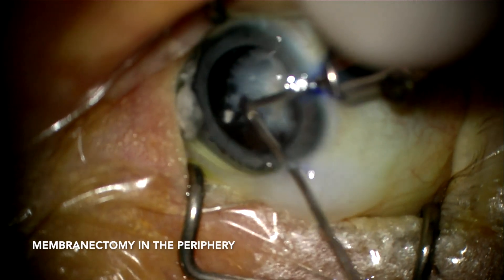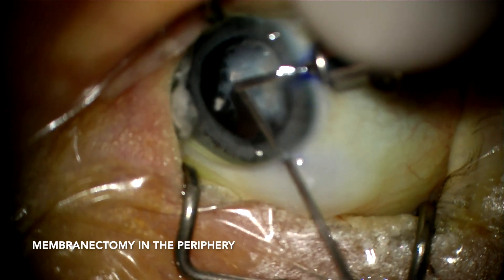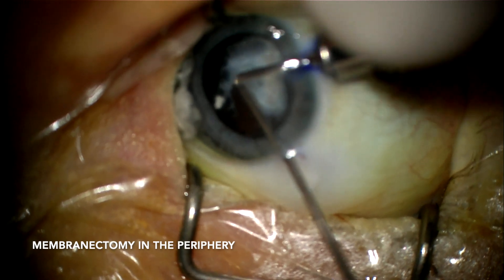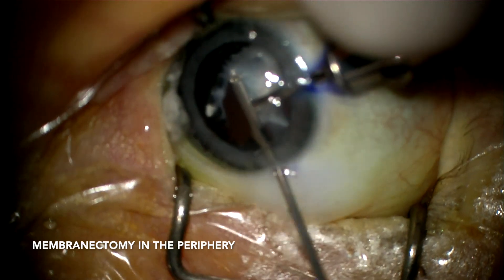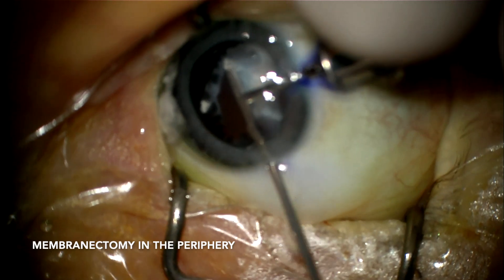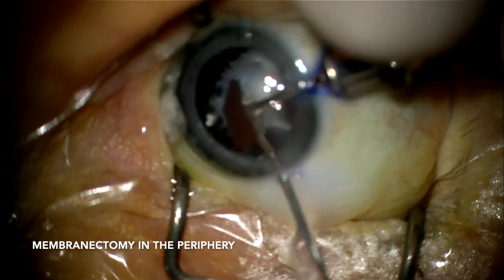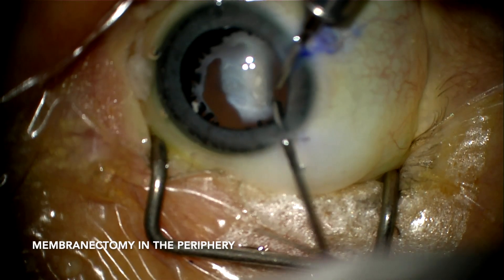Also, we do not want to rip on the periphery, as this can cause traction on the retina. Another option, if the membrane had been too thick, would be to use scissors.